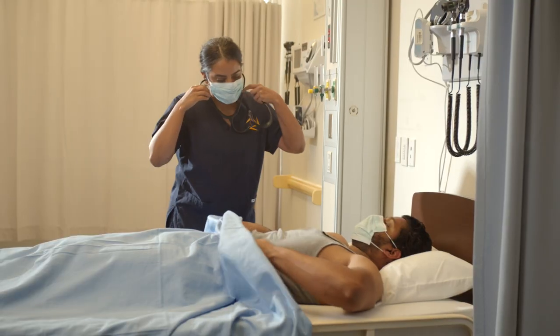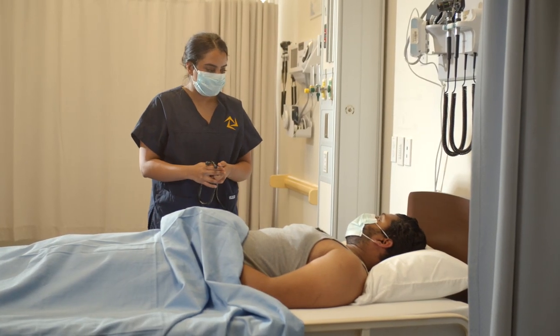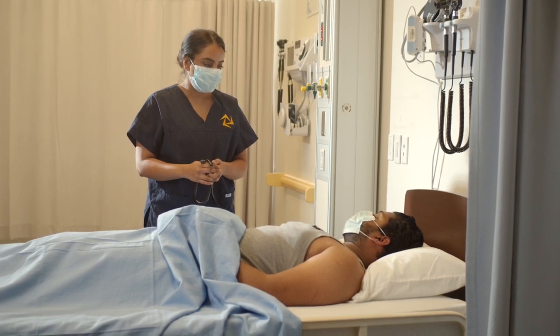You can bring your tank top down. I noted in all four valve locations a clear S1 and S2, no split sounds and no murmurs.